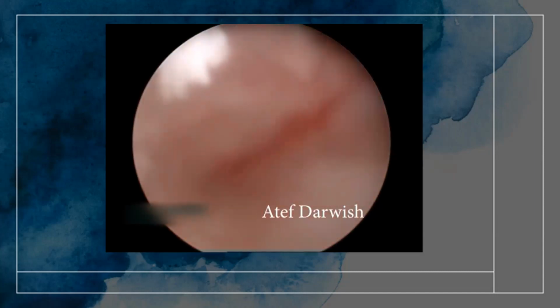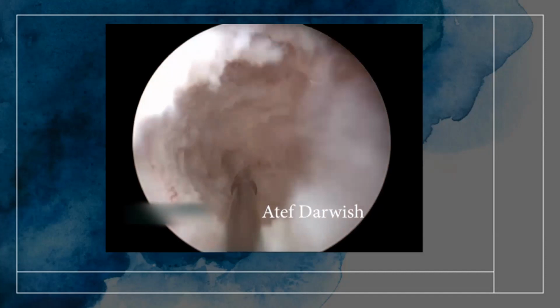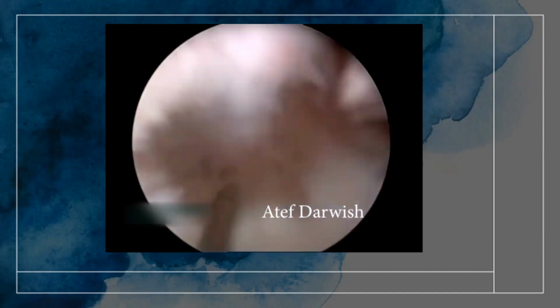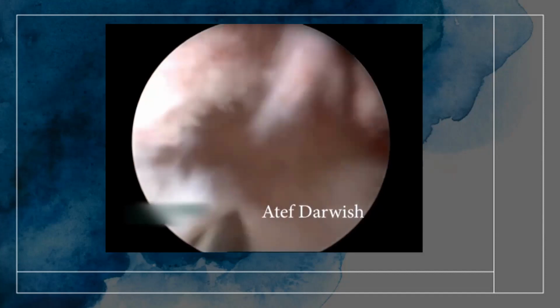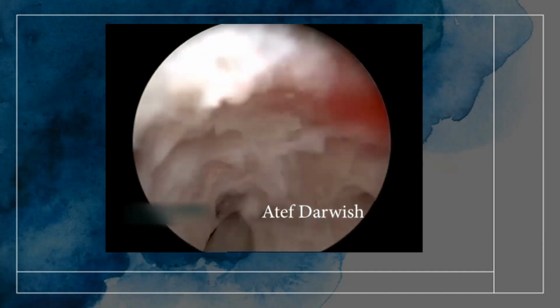The maneuver should be delicate, and you have to go forward, and here air bubbles also go inside the tubal ostium, which means regained patency, but still some fine adhesions require adhesiolysis, until you expose these intratubal fine adhesions inside the intramural part of the fallopian tube.